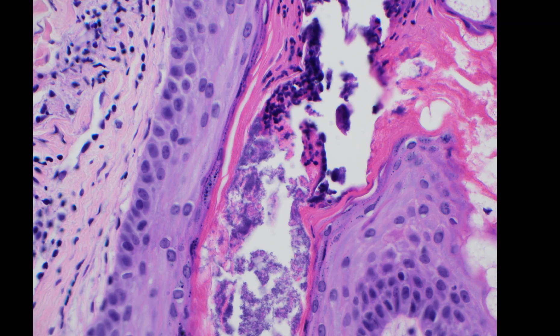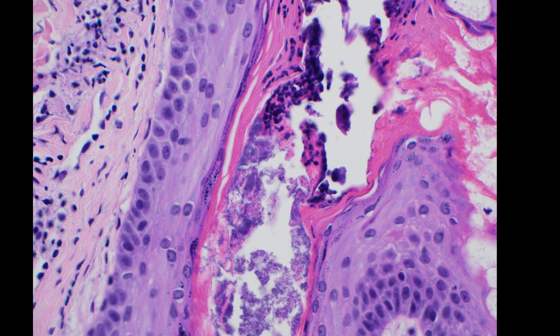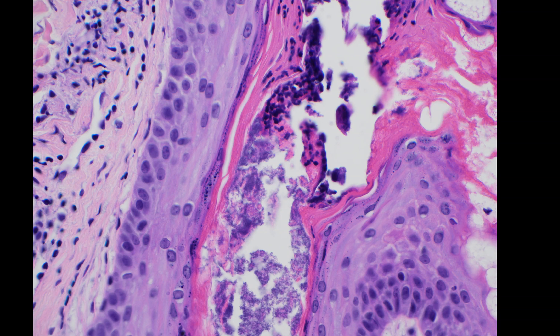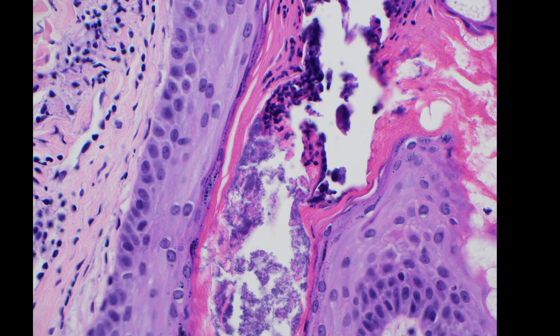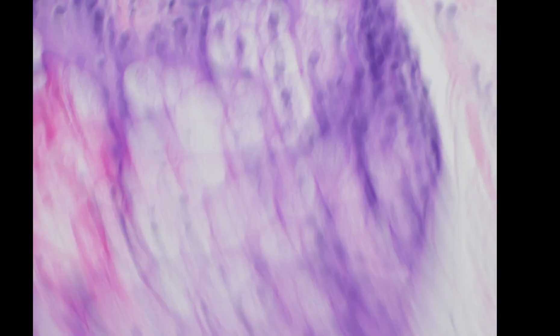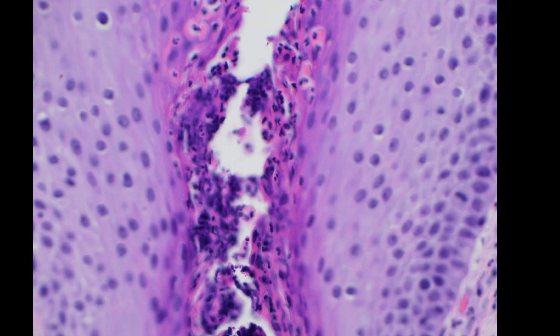So this is bacterial folliculitis. It's very common — probably all of us have had it at some point, either a single little follicle or multiple follicles. It's usually caused by Staphylococcus aureus. It's the same kind of staph that — if you've heard of MRSA, methicillin-resistant Staph aureus — that's just a special type of Staphylococcus aureus that's resistant to the drug methicillin. So this is probably caused by Staph aureus; that's the most common.